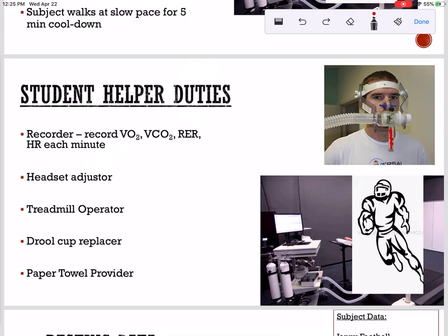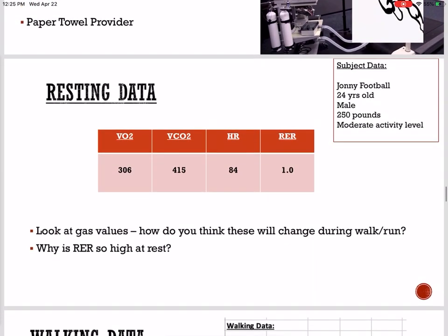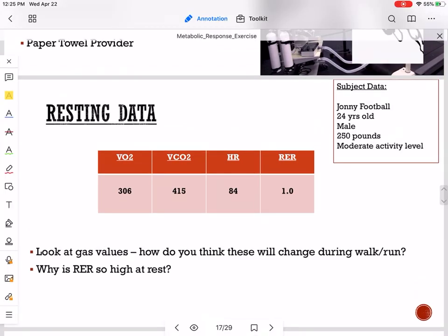You can see coming down from the apparatus is this little vessel. And the job of that vessel is to collect spit. It is kind of an awkward thing having this thing in your mouth. So some subjects tend to be heavy droolers. Some subjects tend to not be heavy droolers. But if we have a heavy drooler, sometimes halfway through we need to pause the experiment and have someone unscrew that little cup and replace it with a new one.